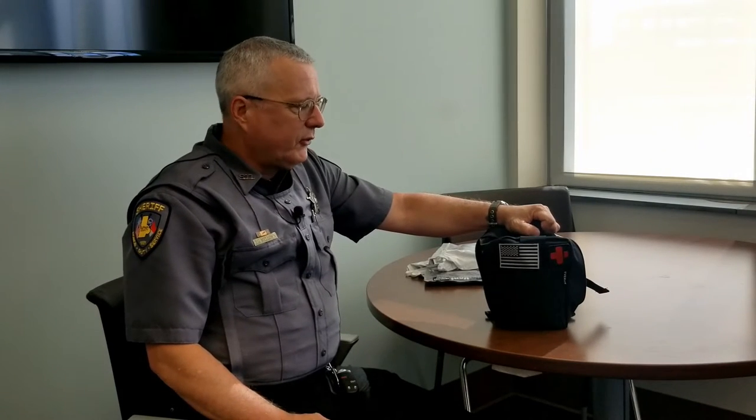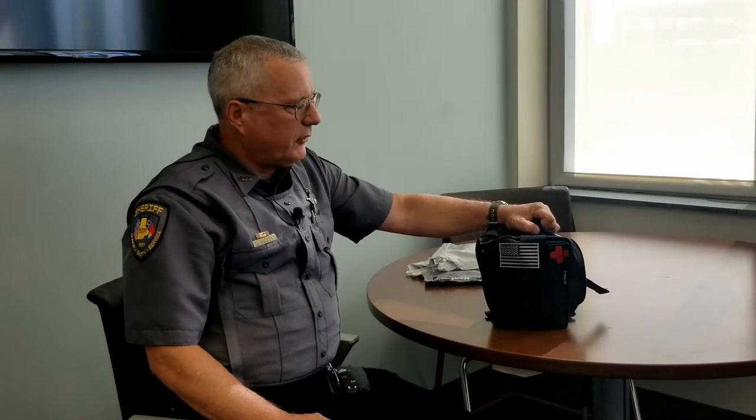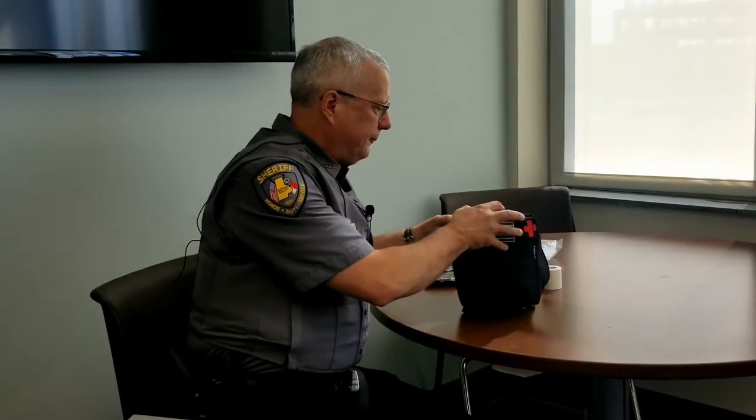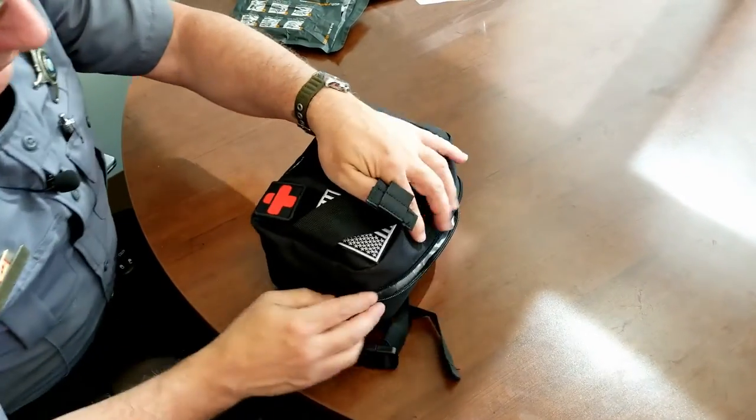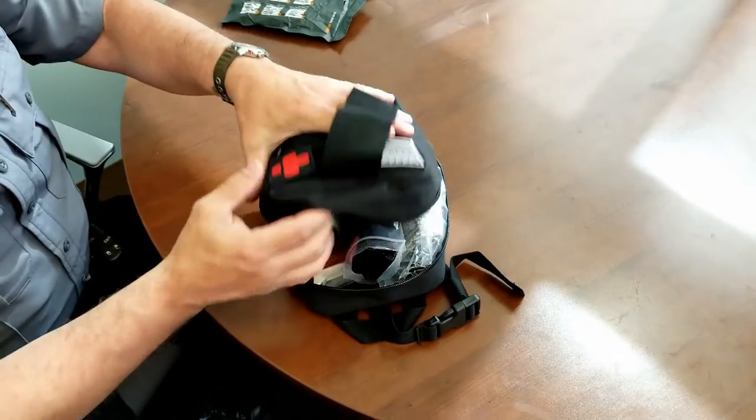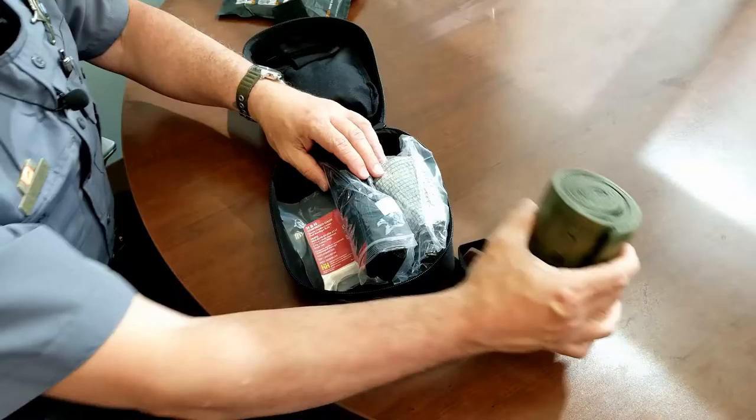It will be stored in the same location in every car, probably somewhere near the headrest on the driver's side. When you open the kit, there are a lot of different things in here, some of which you may be familiar with. I've already opened this. This is a compression bandage — we'll go over this in detail in just a moment.